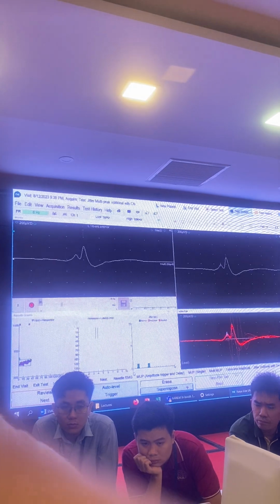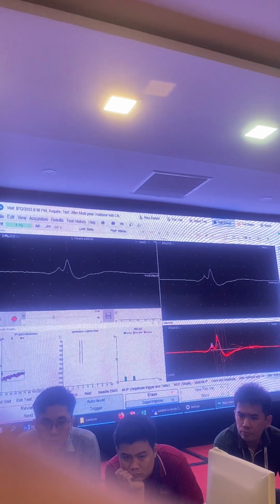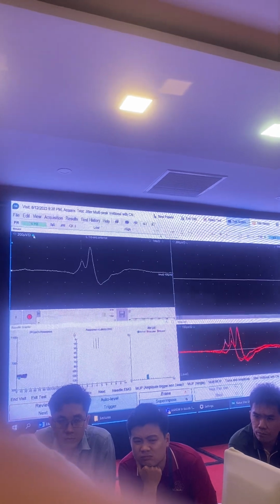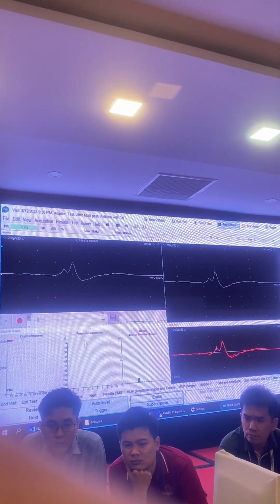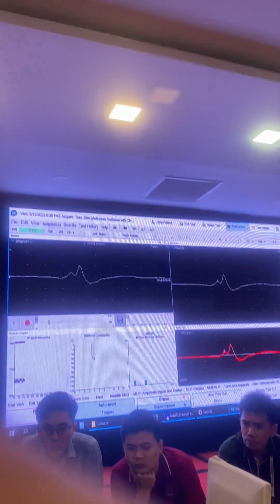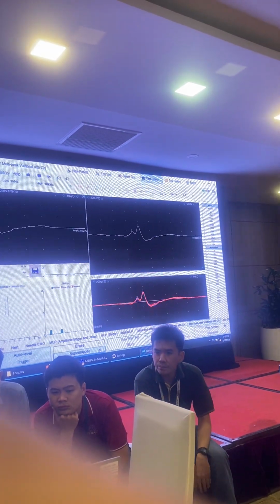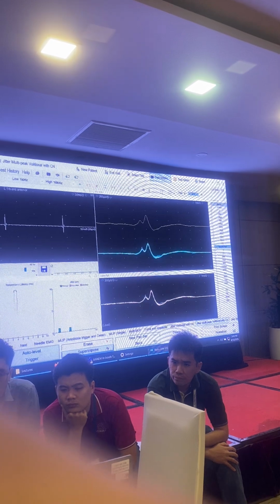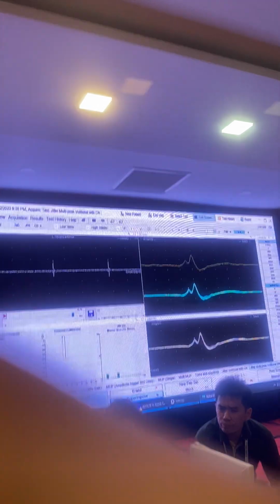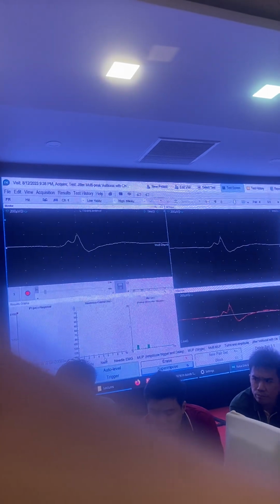Okay, the machine is again triggering automatically. So you can see it is detecting 2 peaks over here, coming from here and here. I stop and it gives me the jitter, okay? Again, that's not the best quality, rise time is not very nice. So, user intervention is always necessary. Let me go to another site.